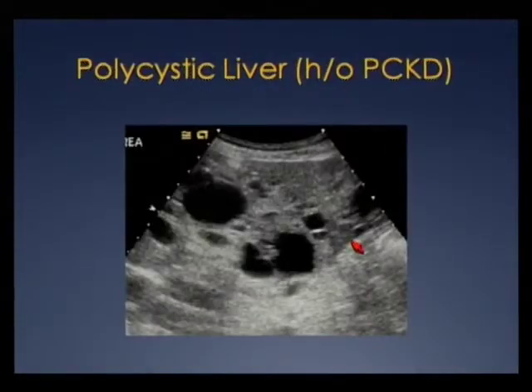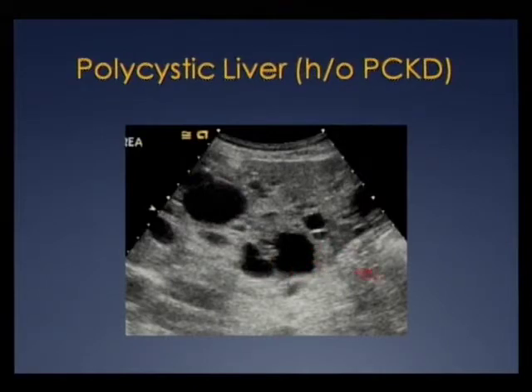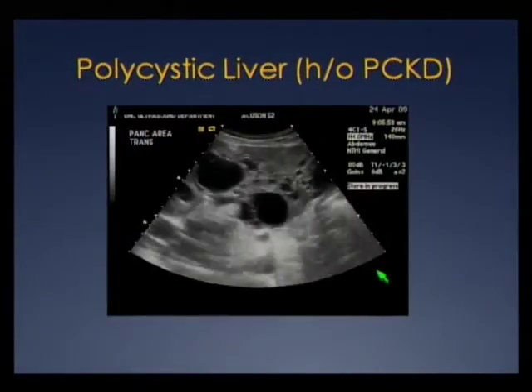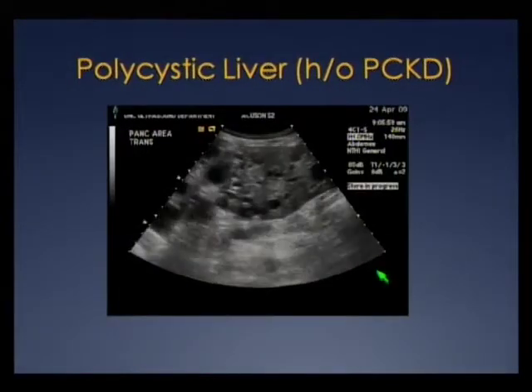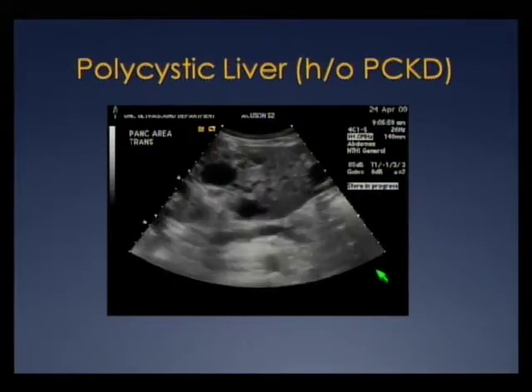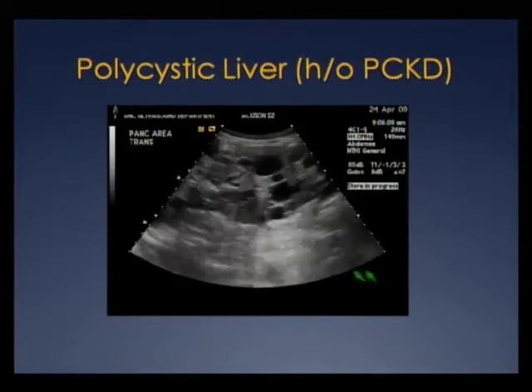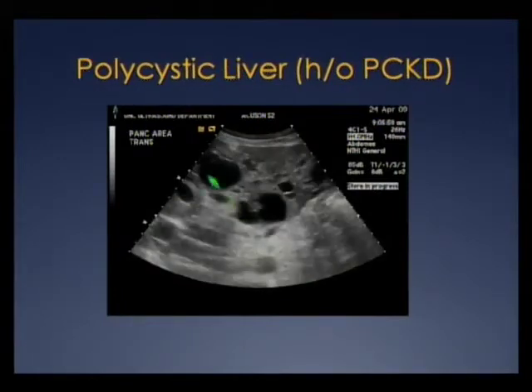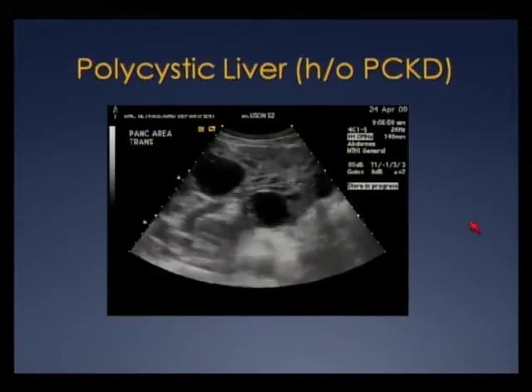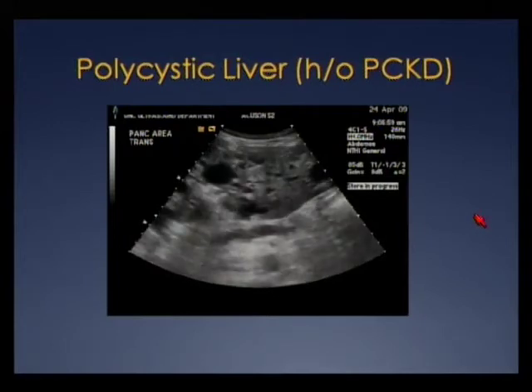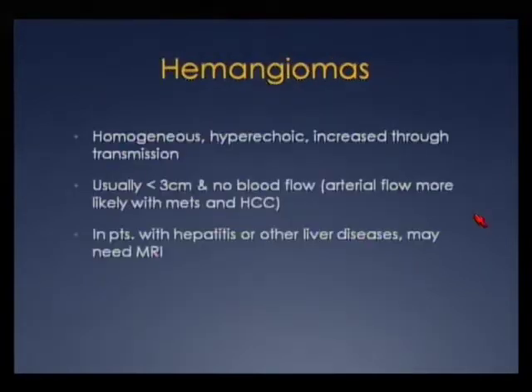Here's a patient with polycystic kidney disease who also has multiple cysts within the liver — polycystic liver. Notice that some of the cyst walls are a little irregular, and that's okay. The cine images of the same patient show anechoic lumens — very simple — easy to call those cysts.